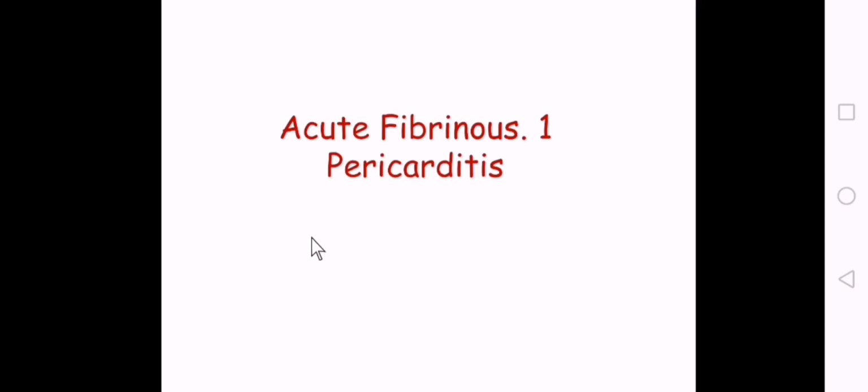الشكل الثالث اللي هو acute suppurative inflammation when there is an infection by pus forming bacteria. اللي عرفنا أهم أمثلة هي الستاف أوريوس والستريبتوكوكس بايوجين، فرح يصير pus formation فسميته suppurative inflammation. وقلنا المثال عليه هو acute suppurative appendicitis. وآخر مثال هو ulcer when there is a local defect in the surface of an organ or a tissue. وعرفنا أهم مثال هو peptic ulcer.